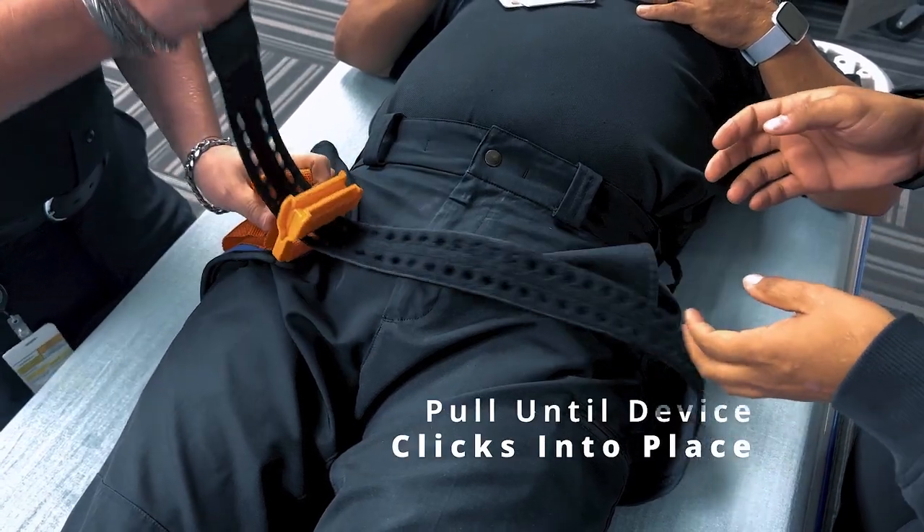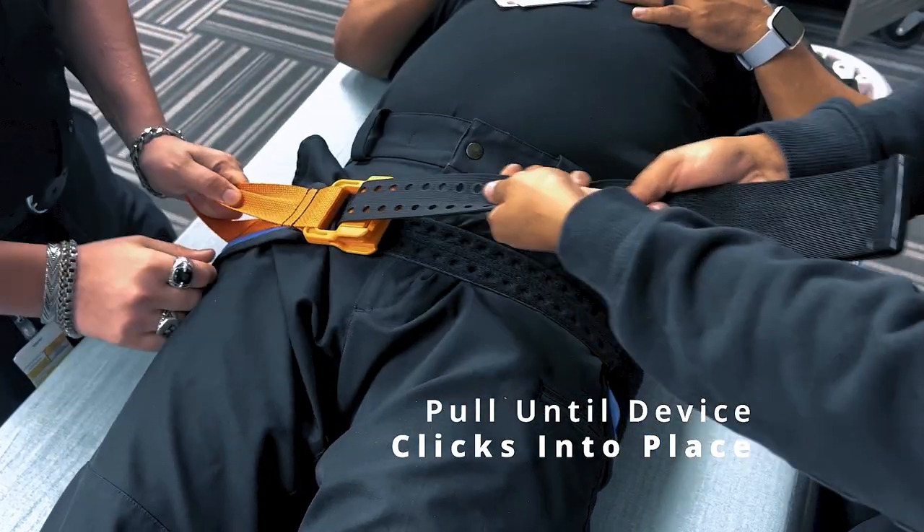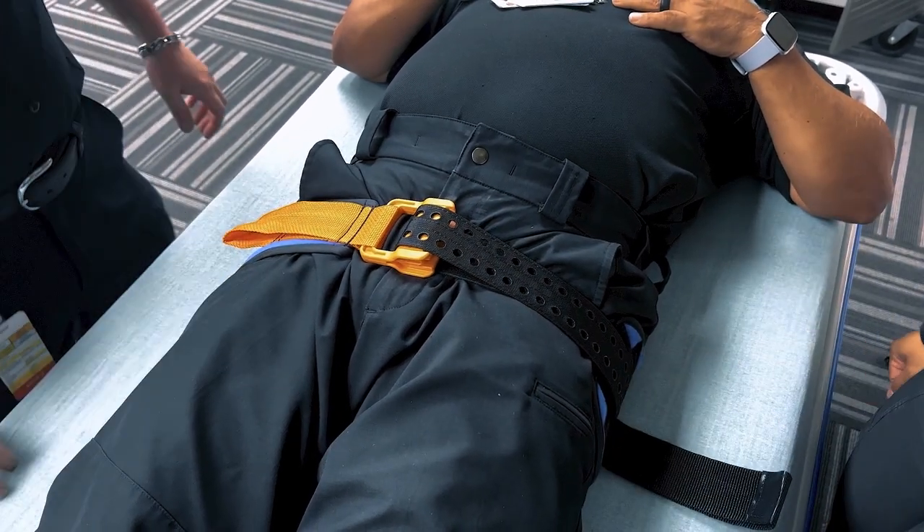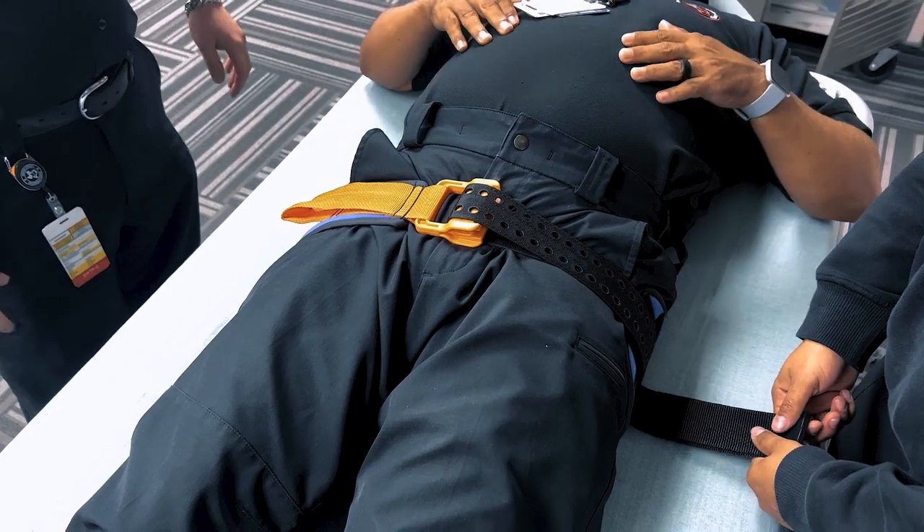Once the pelvic binder is in place, ensure that the patient's pelvis is stabilized and that there is no visible bleeding. Check the patient's pulse, respiratory rate, and blood pressure to monitor for any changes.